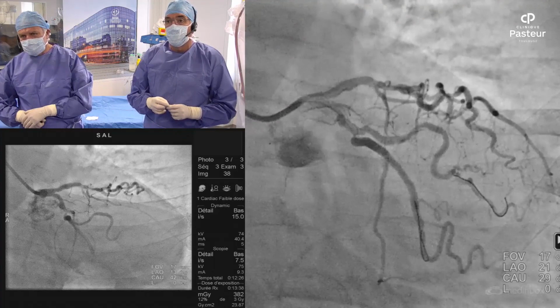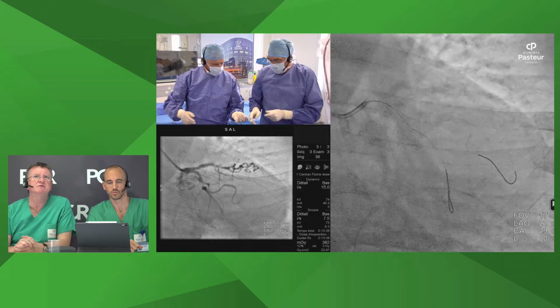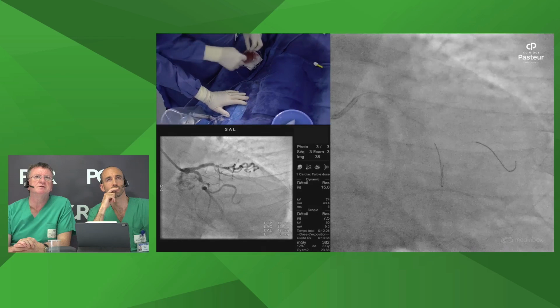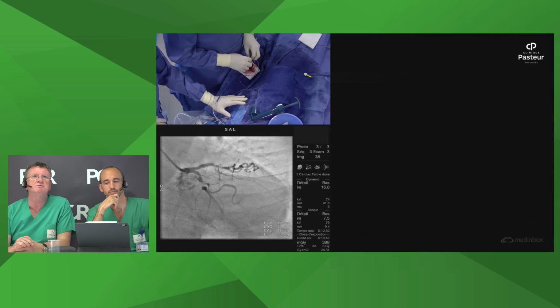And we have a couple of questions from the audience about the guiding catheter. It's a 6 French guide that you've chosen. You're entirely happy to work multi-stent bifurcations through a 6? I think most people are nowadays. And the configuration, you told us it's an extra backup type configuration. Is that right? Yeah, right. Extra backup 3.5. If you're a radial operator, it's important to understand that you need to get your guiding catheter optimally deployed and positioned at the beginning of the procedure. If you start the procedure with a poorly functioning guide, it will certainly deteriorate during the course of the procedure.